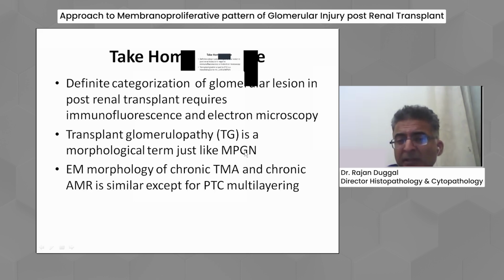activity in the biopsy. Because the newer Banff, the last Banff meeting, highlighted that there could be antibody mediated rejections where there is only microvascular inflammation, MVI. C4d is negative, even DSA is negative. They say that there could be anti-endothelial antibodies which are causing this, or these are anti-HLA antibodies which are not picked up at the routine DSA. But I must tell you, this is not a very common scenario.